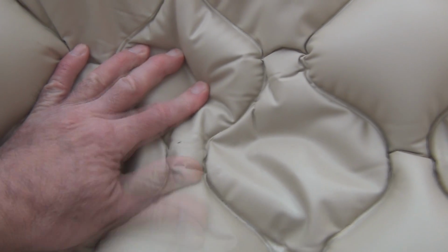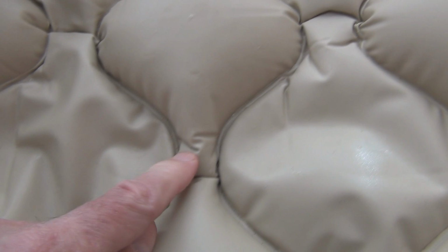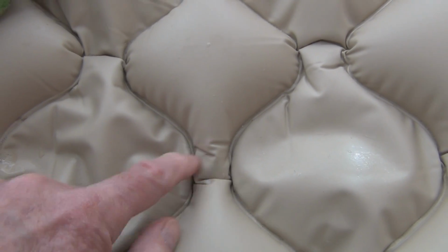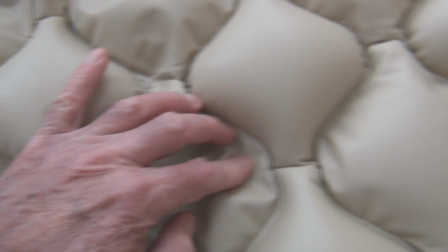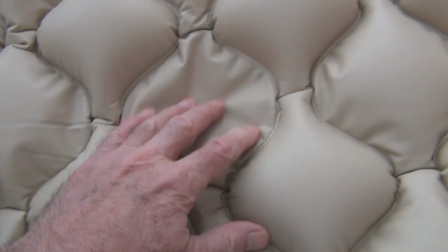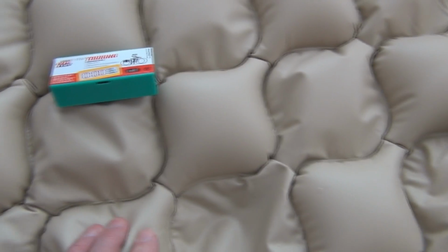Okay, and here it is here. You can see right there. You can hear it. And that's sort of where there's a natural crease. So that just wore. It's probably a good idea to take this off occasionally, even though you're cleaning the sheets, because it looks like a lot of debris collects in all these seams. A lot of dust and just looks like particles of sand or whatever people accumulate on themselves as they're going through life, you know, lint and stuff.